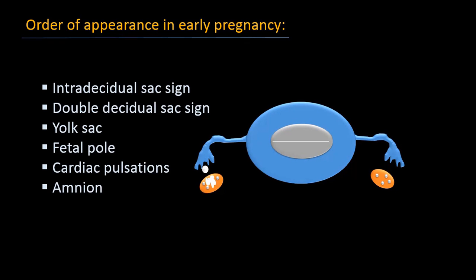To review the order of appearance in early pregnancy: first, the intradecidual sac sign; then the double decidual sac sign; then the yolk sac; then the fetal pole and cardiac pulsations; then the amnion.